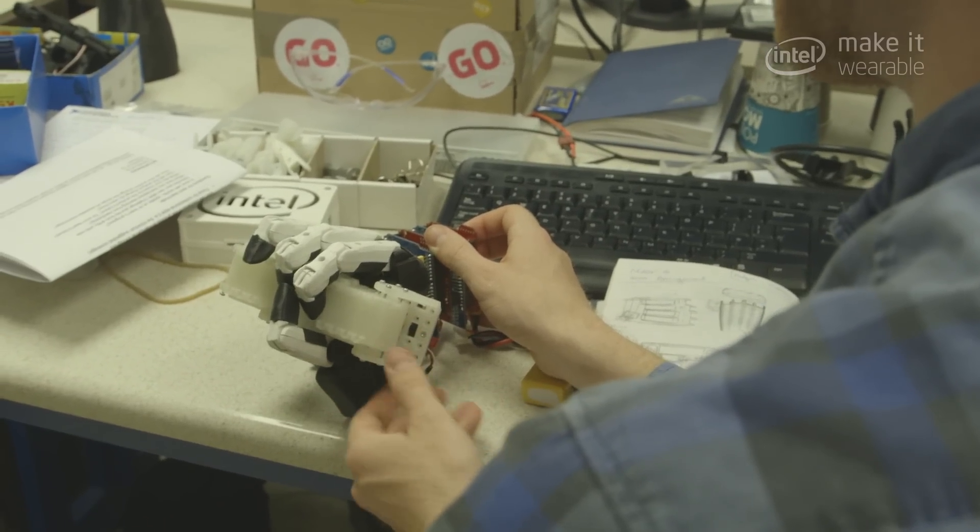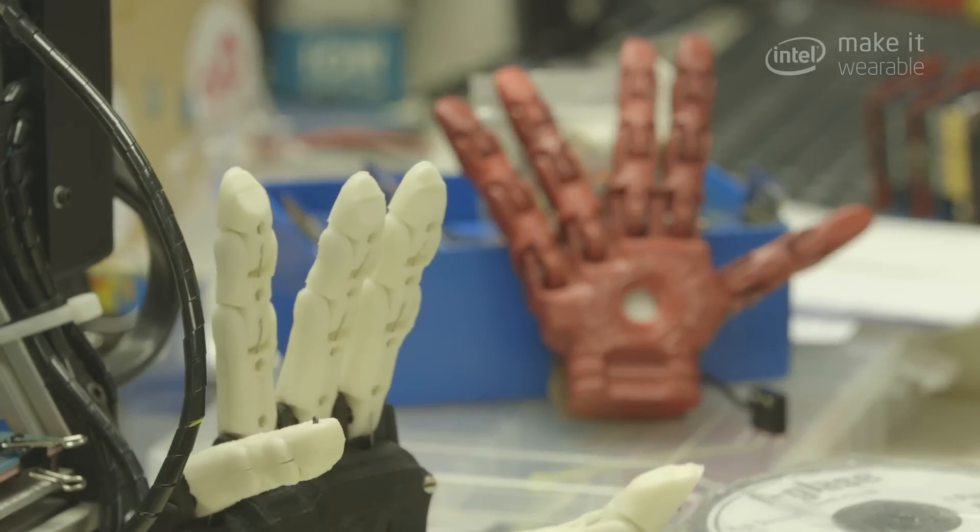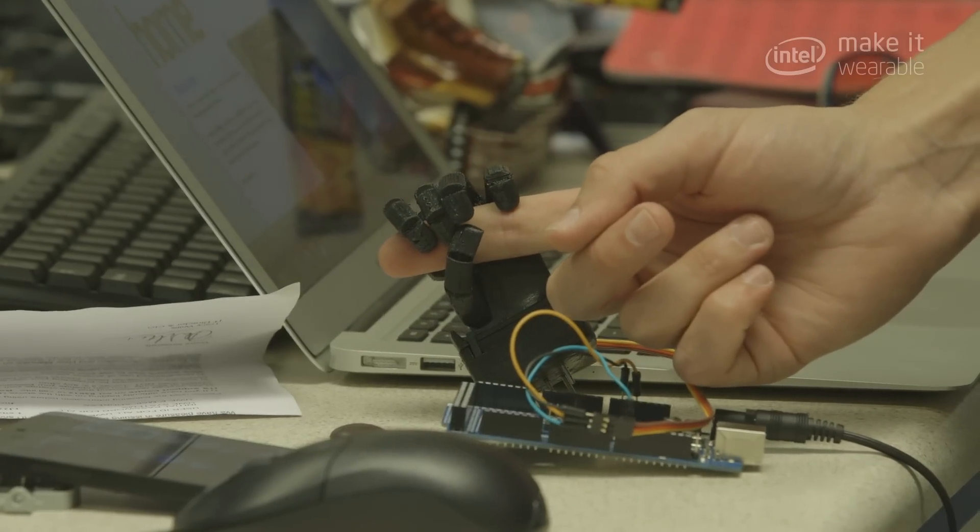It has tendons just like your human hand and then a rubber surface to act like the skin, and actuators pull the tendons which make the fingers move.